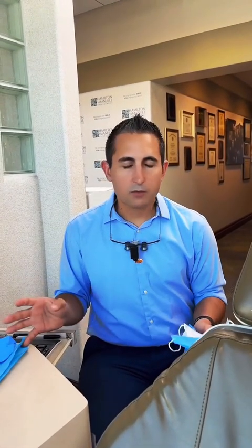And what can I expect as far as pain? So with getting the expander out, about 4 out of 5 people don't want to be numb at all for it because getting the pins out is a lot easier than getting the pins in. So a lot of times what we'll do is we'll see how you do. We'll start to remove one of the pins, and you'll tell us, hey, that's no problem at all, or you'll tell us, hey, I want to be numb. And so if you want to be numb, we'll get you numb, and then we'll get the rest of the pins out. The expander will come out. And then after that, it's mostly just computer work to get the new aligners.